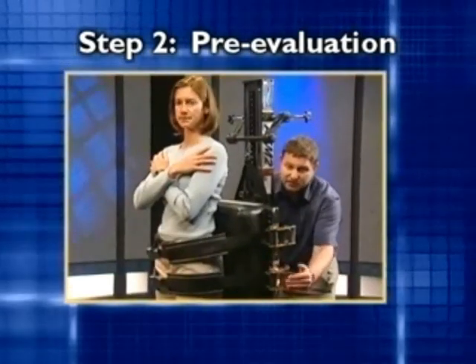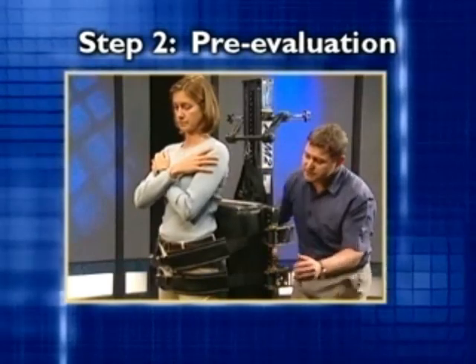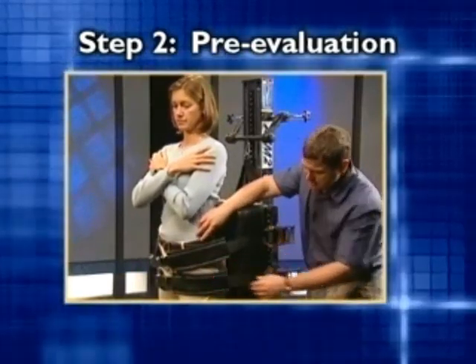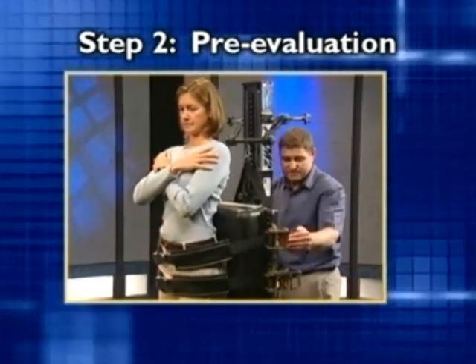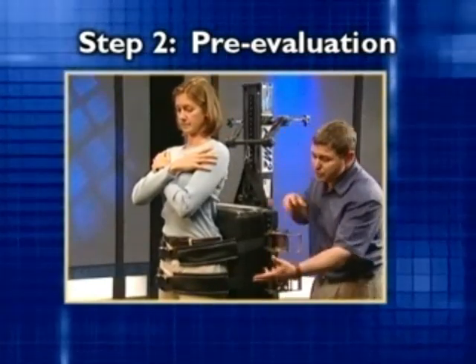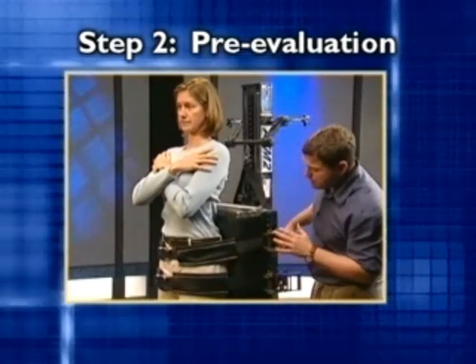Adjust the belt's height or tightness to achieve a zero pain movement. Good communication between the clinician and the patient is vital at this stage. You need to give your patient a clear understanding of the setup's purpose and their role to accurately report sensations, the most comfortable placement of the belts, and rotational forces applied by the ratchets.